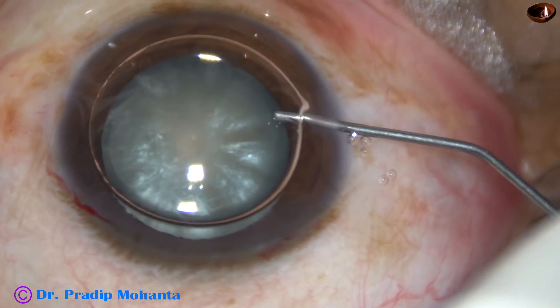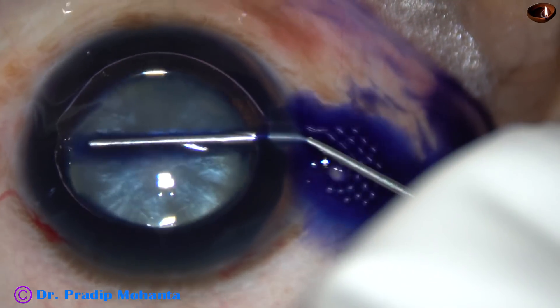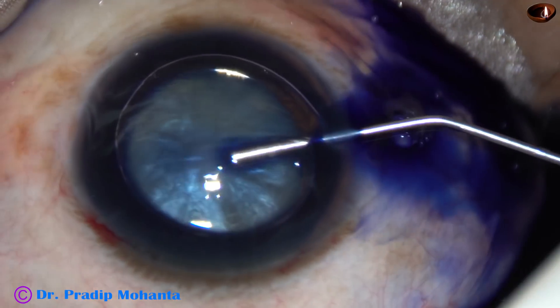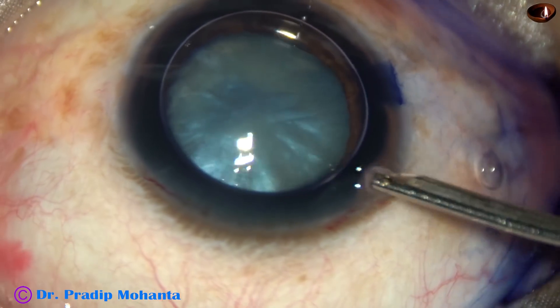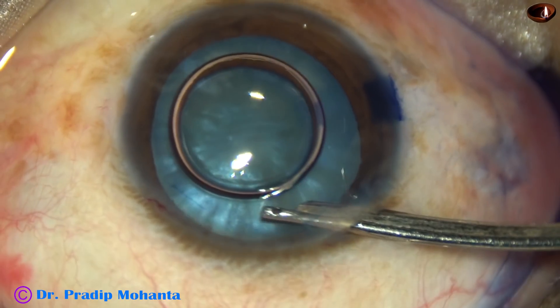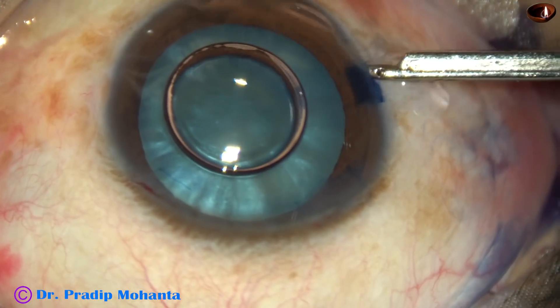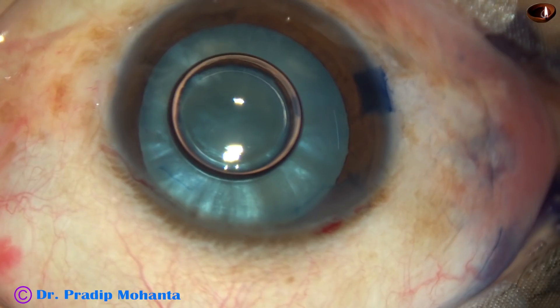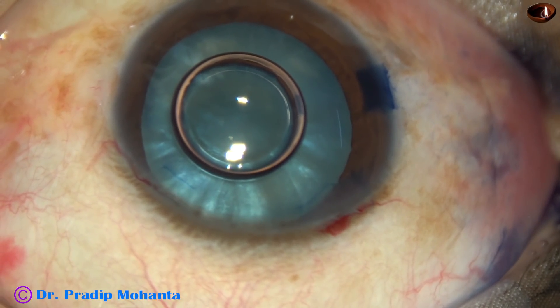I have my own way of doing it using only hydroxypropylmethylcellulose as viscoelastic substance. After the main incisions, I stain the anterior capsule with trypan blue dye, wash the dye out with BSS, and then I use only 2% hydroxypropylmethylcellulose as the viscoelastic substance.